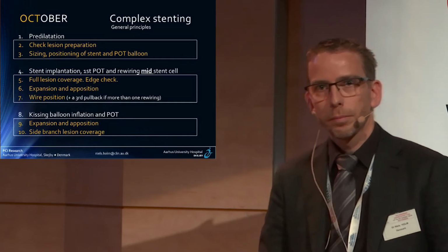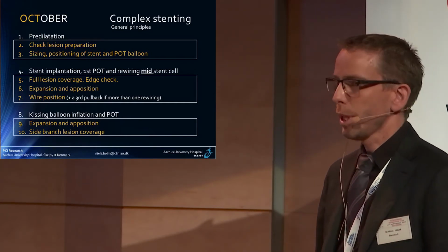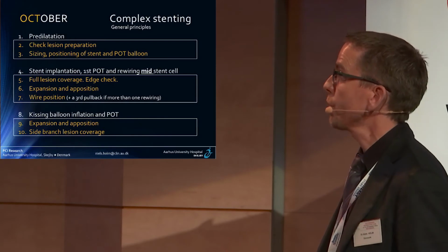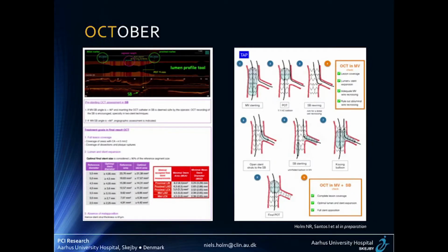So to teach this and to communicate this, we have developed a quite extensive protocol that will be formed in posters and handouts. It will also be published very soon in a trial paper. This is just 2 pages. It's several pages long, on how to do this OCT guiding.